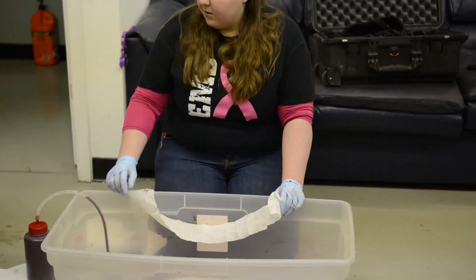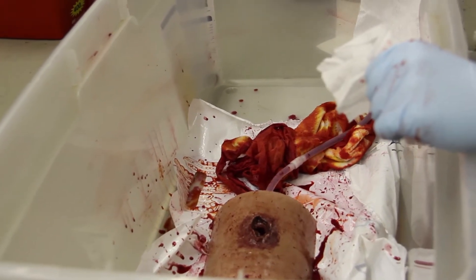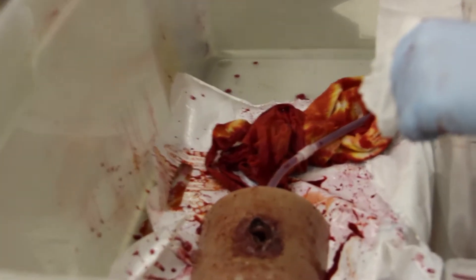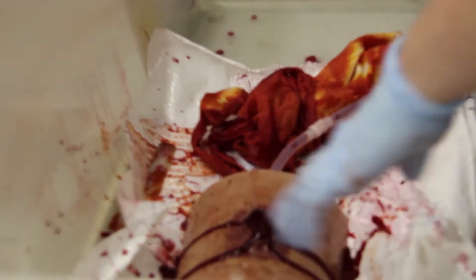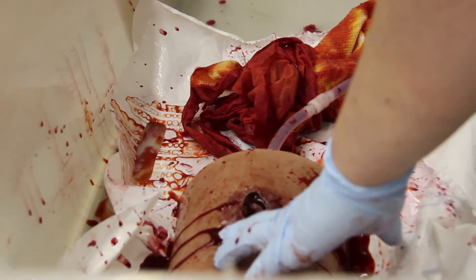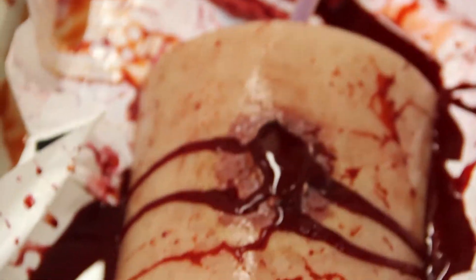As we start squeezing this — go ahead and pick it up and start squeezing — this would be like, oh no, he's just been shot. It's so realistic, it's pretty cool. Squeeze harder. So this is the blood coming out. If I stick my finger in there, you see how it's going everywhere. Put a lot of pressure on it because your body has a lot of pressure, especially in a leg wound.